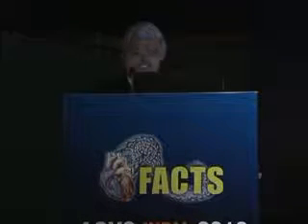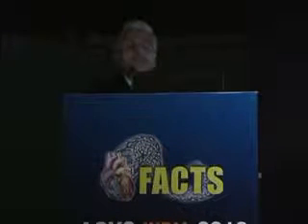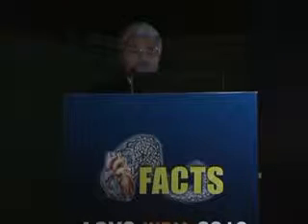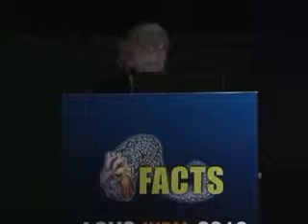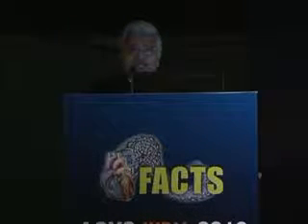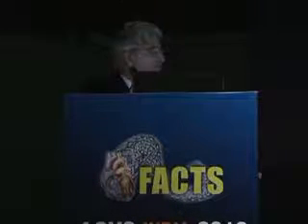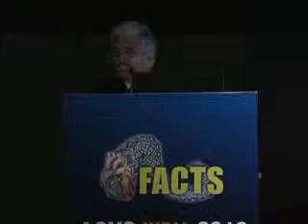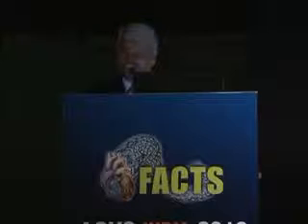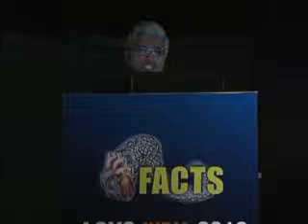Evaluating a coronary artery fistula, you would definitely require a coronary angiogram, not necessarily by an invasive procedure to begin with. We would consider a CT angiogram very useful, not only to show the anatomy and to confirm the diagnosis. In practical terms, when you need to plan what you are going to do, a CT angio actually tells you that this helps you in making the decision that this is the device or the type of closure that you would employ. And you also need to consider, is this a candidate for surgery as against catheter closure?